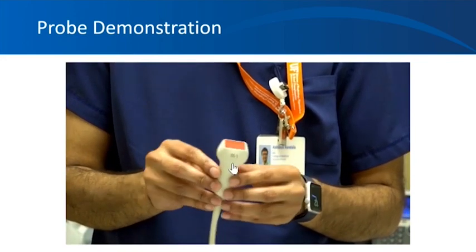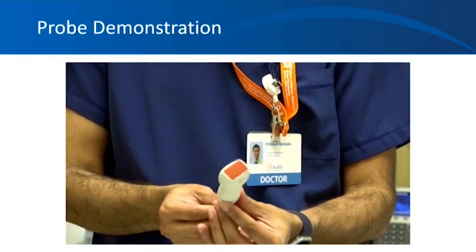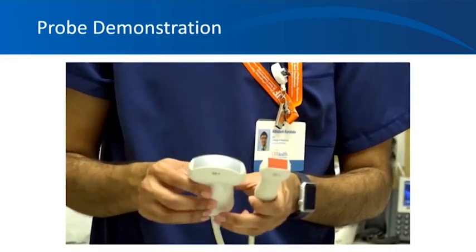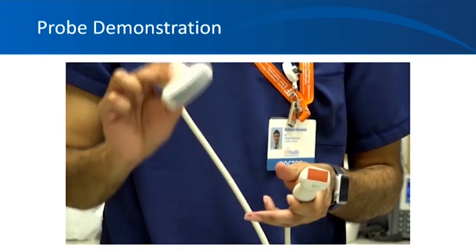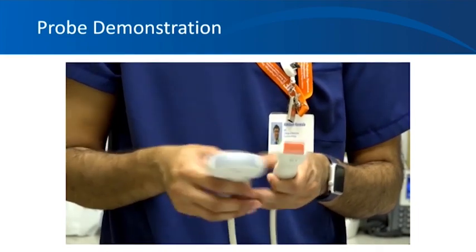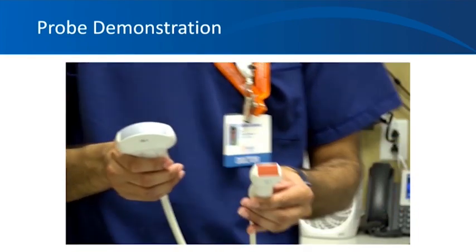And it has a probe marker, and the direction of the probe marker differs based on which echocardiographic window you are using. And you can see the curvilinear probe we use to do the abdominal ultrasound. If you put the curvilinear probe and try to do cardiac ultrasound, you'll get a lot of rib shadowing. So the cardiac probe is the ideal one to perform the echocardiography.